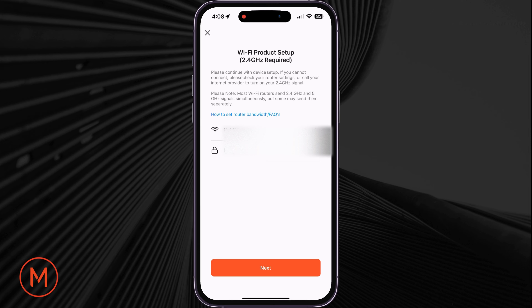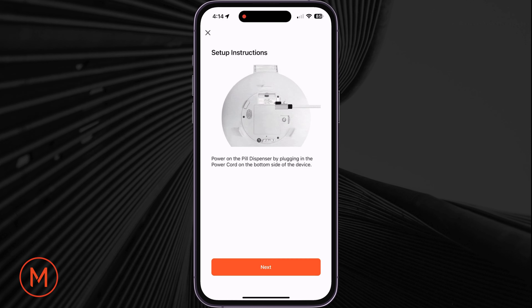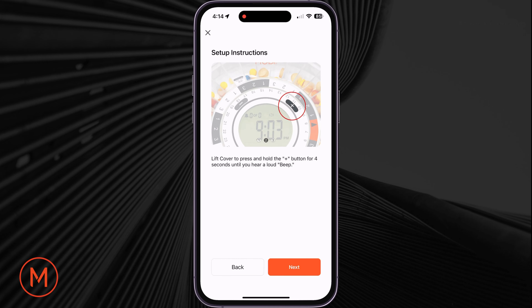Then tap on Next. In setup instructions, first, ensure the pill dispenser is plugged in with the power cord or has its batteries inserted. Once it's powered on, tap on Next. Second, please lift the pill dispenser's cover and press and hold the plus button for four seconds until you hear a beep prompt.